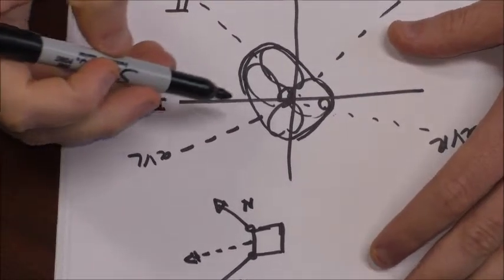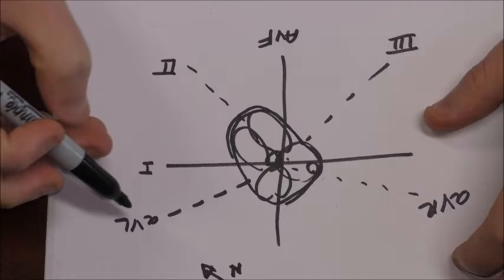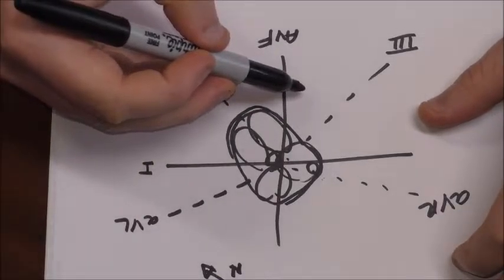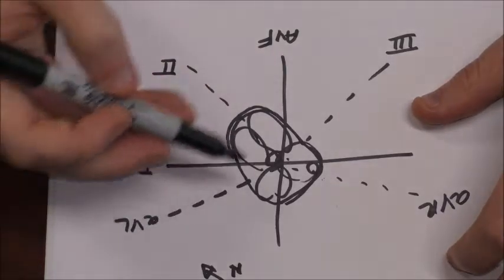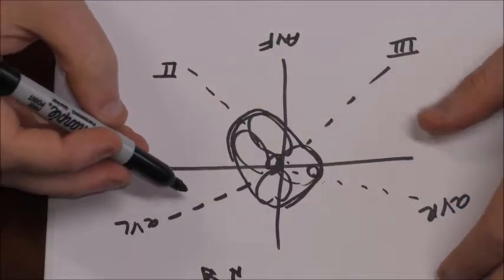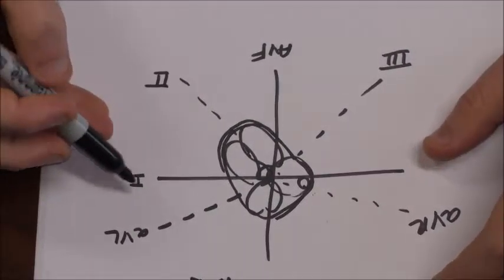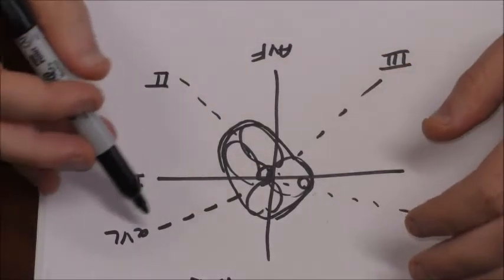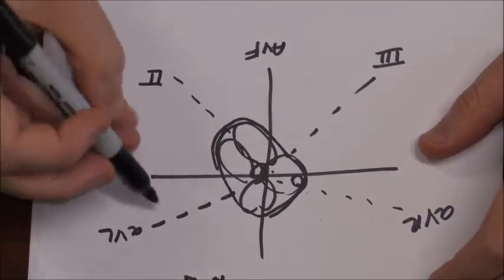So when you're thinking about the heart depolarizing, you have to think of the same concept, that the heart is depolarizing the left ventricle, but the right ventricle is also depolarized, and then the posterior part of the heart is also depolarized. So you have all these different vectors that are happening, and these limb leads are actually only seeing it in the XY axis. Your precordial leads will be the ones that read it in the Z axis.